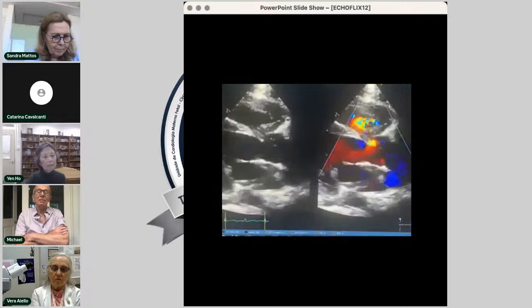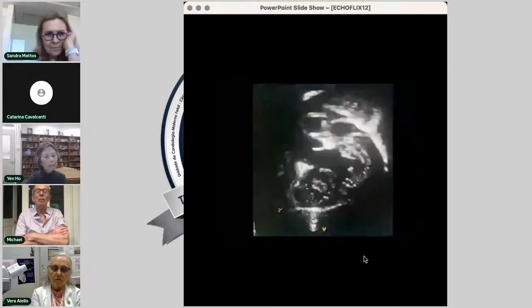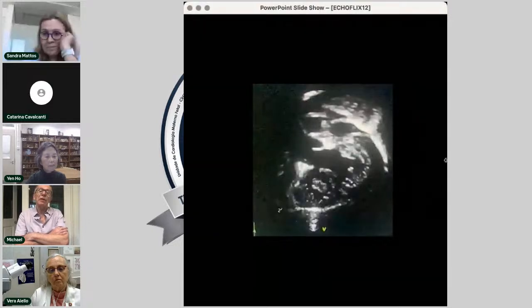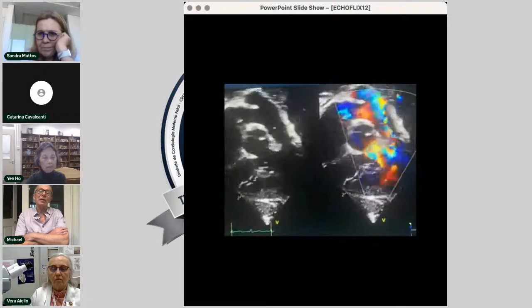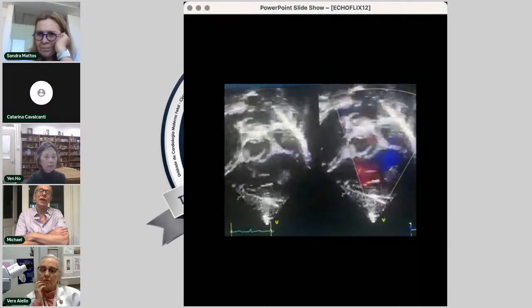Well, we'll probably stop there, sure. But the other thing that we happened to find was that I noticed there was an anomalous origin of the left anterior descending coronary artery from the right coronary artery going across the outflow tract of the right ventricle. In fact, what we did find was dual LADs, one normal LAD and one rather large LAD from the right coronary artery. And the cardiac surgeons, the morphologists will tell us the significance of that.